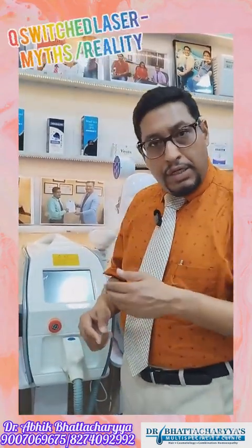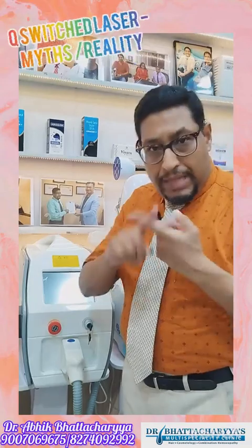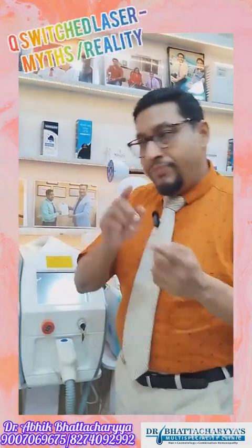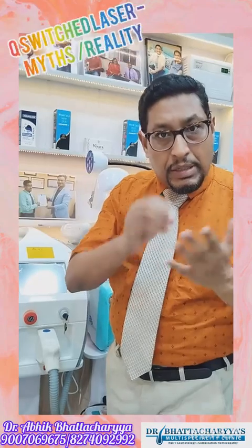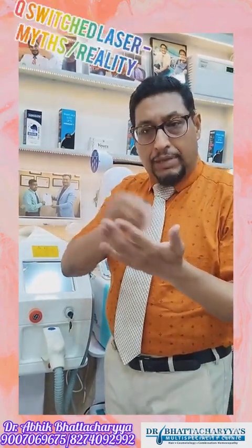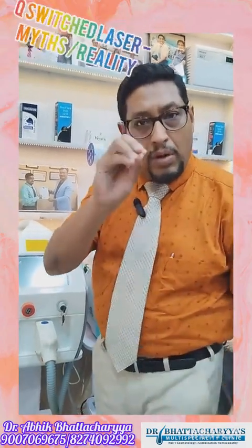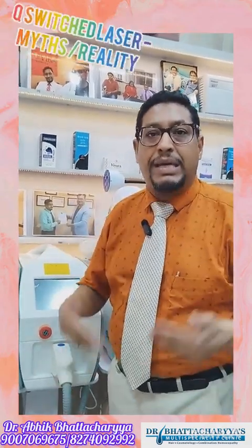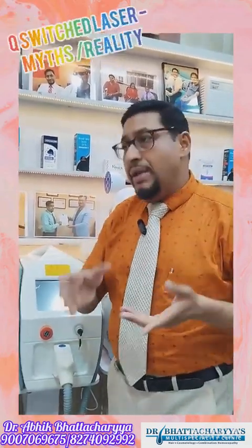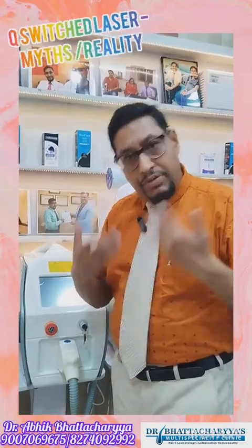If it is a pigmentary lesion, it is called the photoacoustic phenomenon. The light absorbed by the chromophore helps to destroy the pigment particles: a bigger pigment particle is broken into smaller pigment particles, which can be drained easily by the lymphatic drainage of your body.